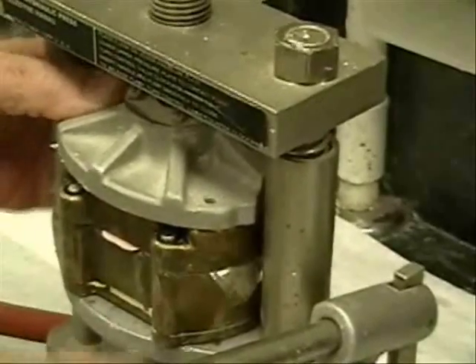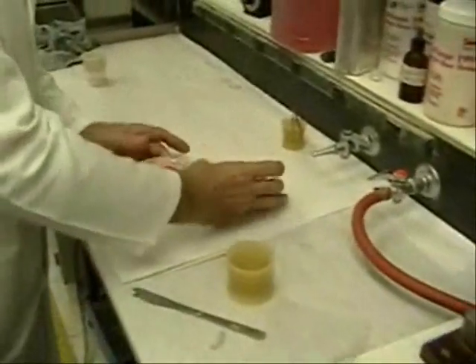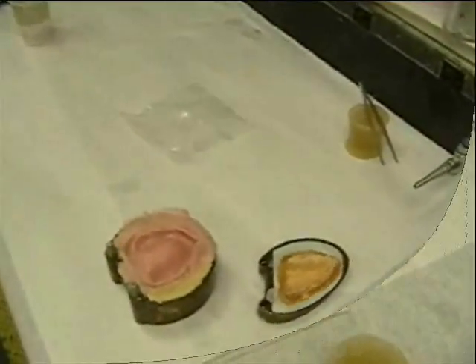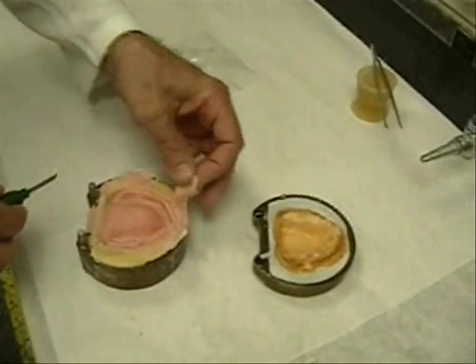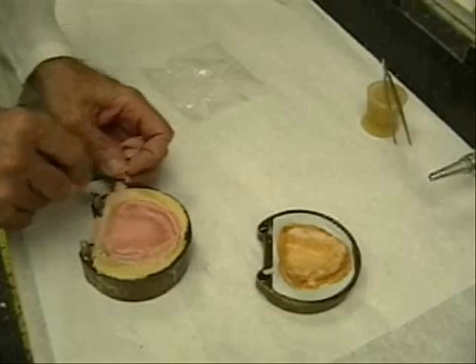The flask is removed and reopened, and excess acrylic is removed. If voids or deficiencies are noted during this initial trial packing, the excess acrylic resin is used to correct those areas.